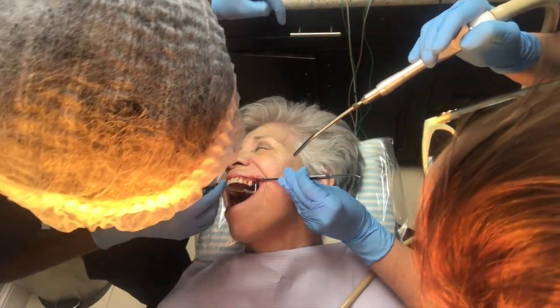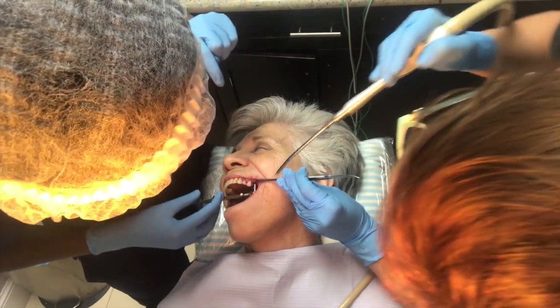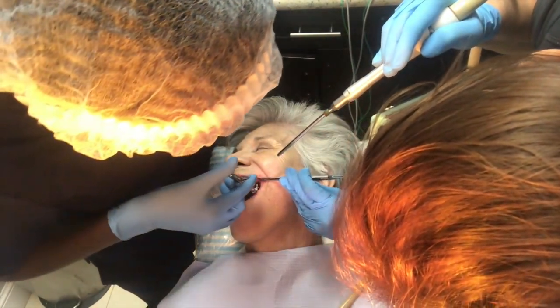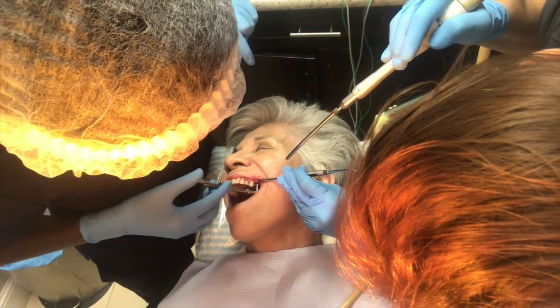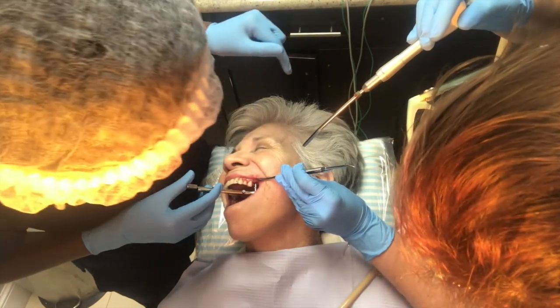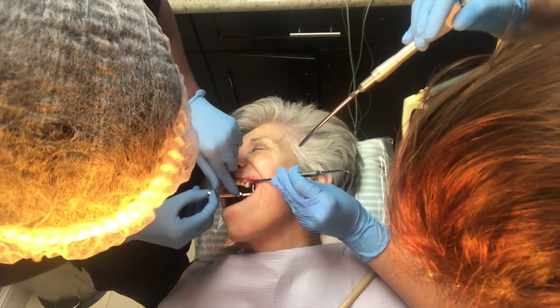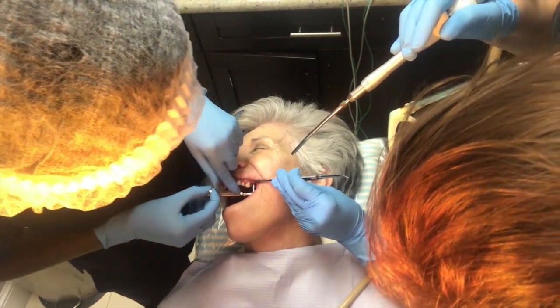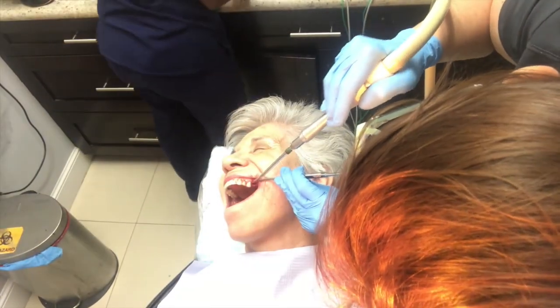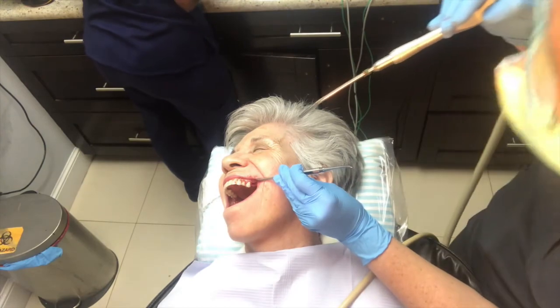My assistant is suctioning the blood just so that I can make sure that I'm right below the gum line, because even though implants are more of a functional appliance, we do care about cosmetics. We want it so that you can't see the silver rim of the implant or the abutment, and in order to do so we have to make sure that the implant goes all the way down.